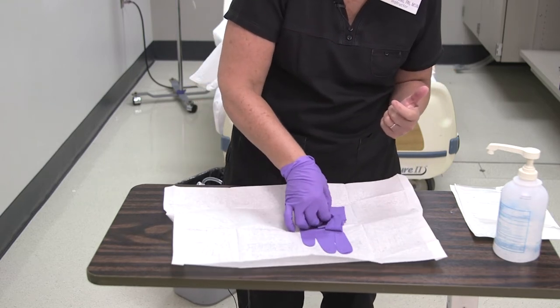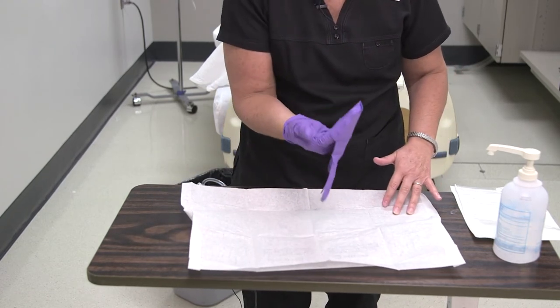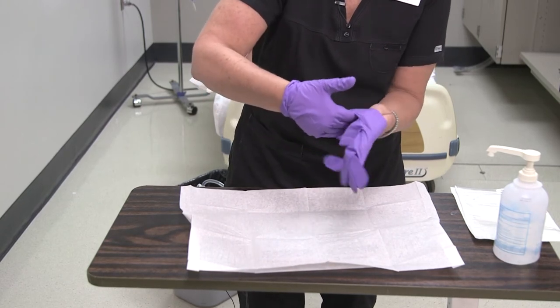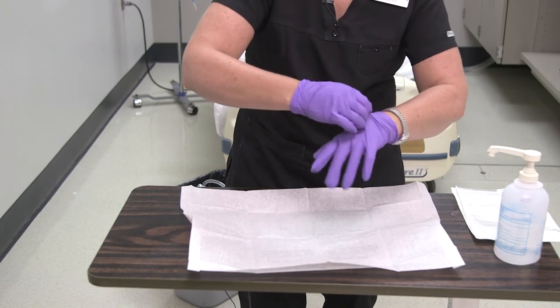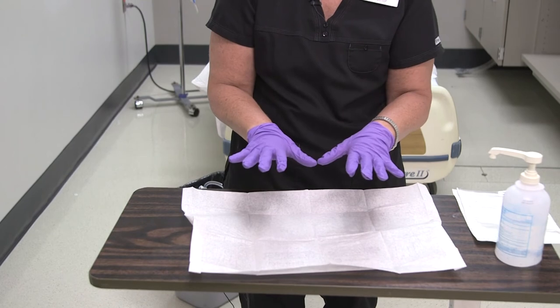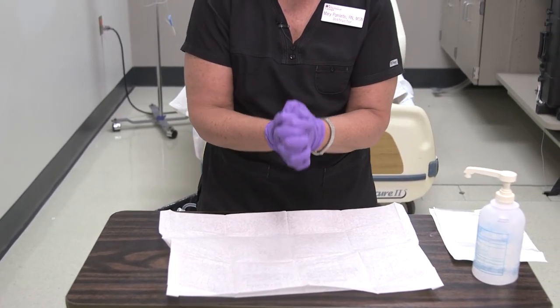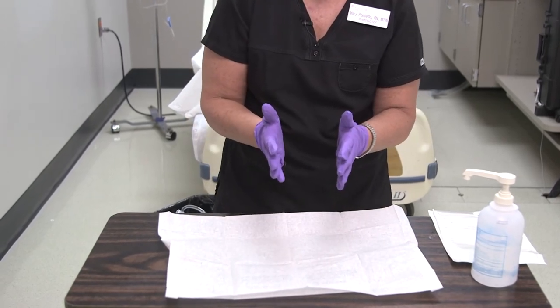And then this one, I'm going to do the opposite. I'm going to grab inside the cuff. So it's going to look like that. Put my four fingers in first, slip it over, pull back. And you can also loosen this up a little bit if you need to. So now I have my sterile gloves on, and you just want to make sure that you're aware of that. When I'm done, I always just fold my hands, keep them close to my body so that I'm aware that they're sterile.